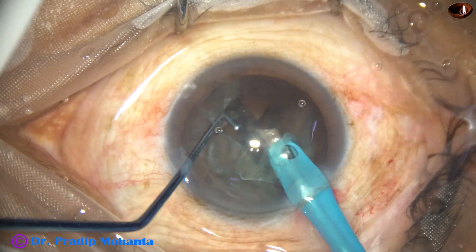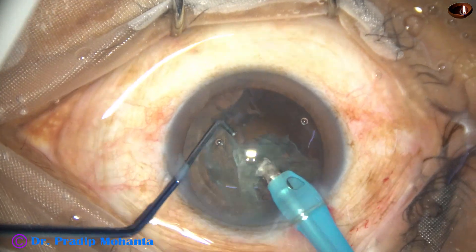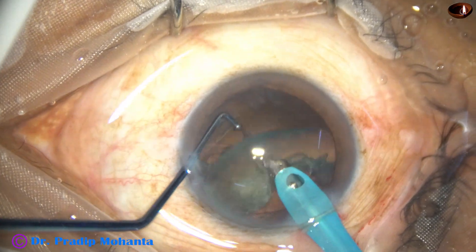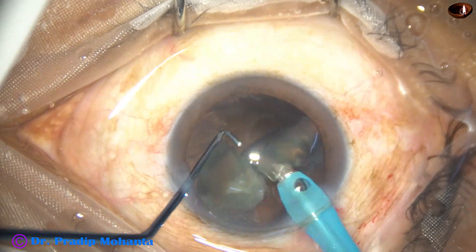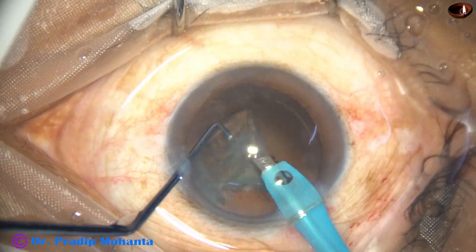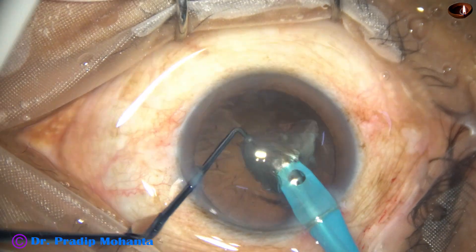This instrument is very useful in soft cataracts. In hard cataracts, it can be done with practice. This is the hemi nucleus — it can be easily chopped by the ball-tipped sustainer into pieces.